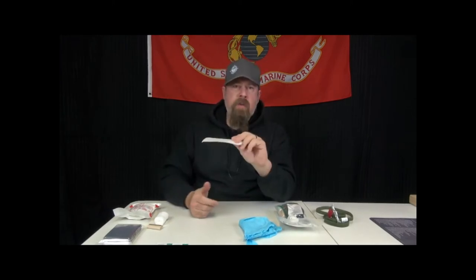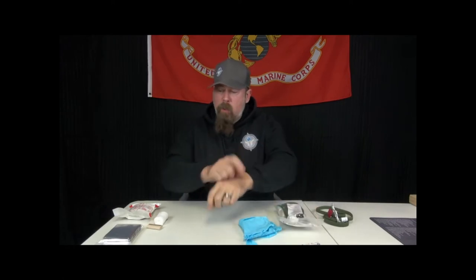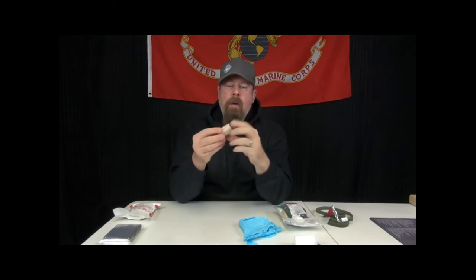An adhesive bandage for those things that don't require tourniquets, but you still should cover the wound anyway. A couple of alcohol wipes to clean the wound before you put the bandage on. A mini gauze. You can use the mini gauze to wrap or to pack. Got the tan colored duct tape here, 3 feet of it. We've got a Mylar space blanket to keep your patient from going into shock and keep them warm after you've treated them.